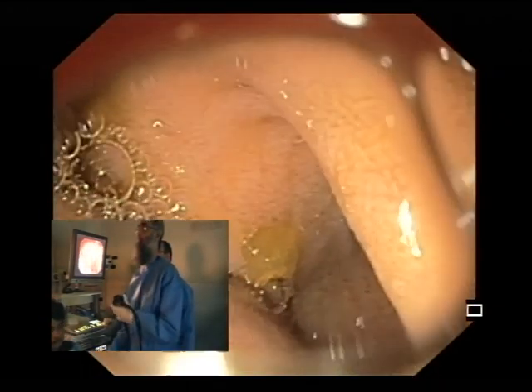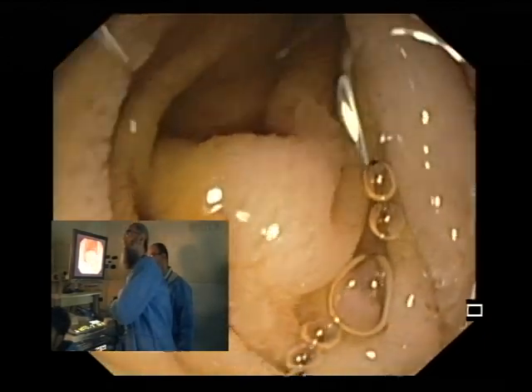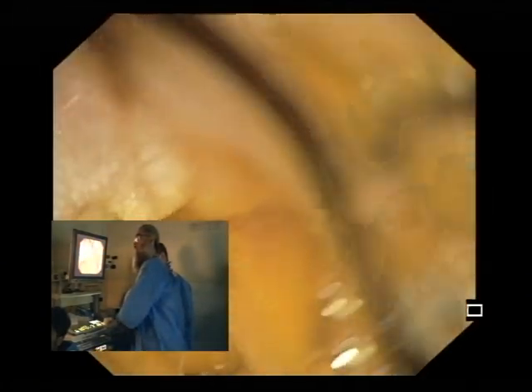Here and then thumb down, small wheel to the right, and big wheel towards you. And now try pulling. You almost, yep, you got it. Very good. Let's go to the cut.